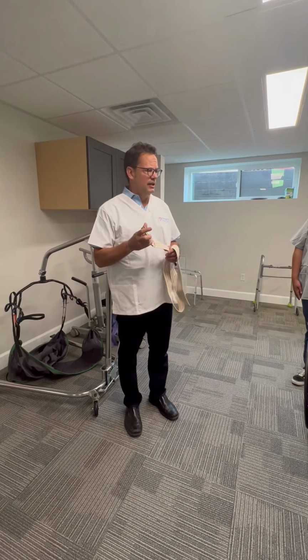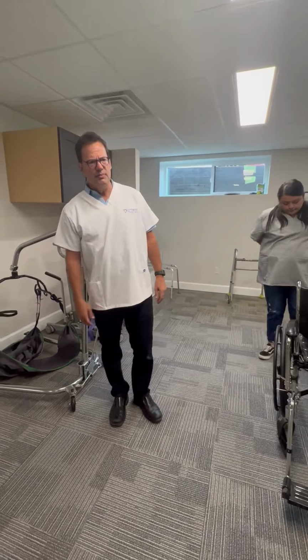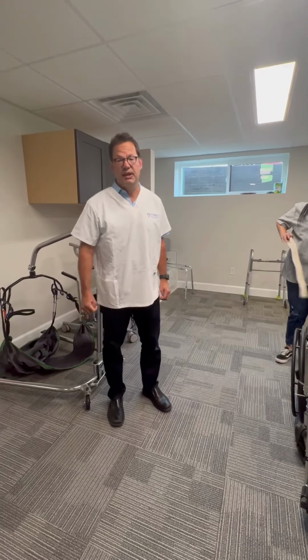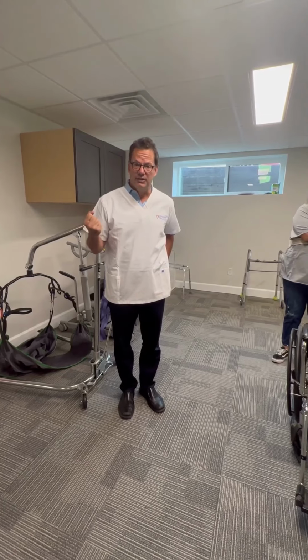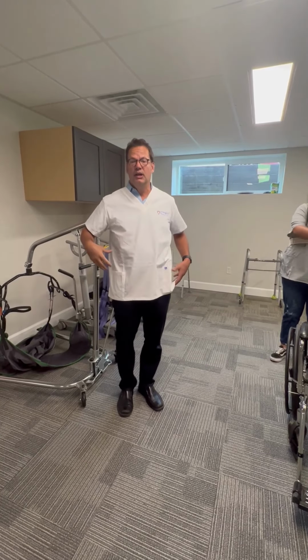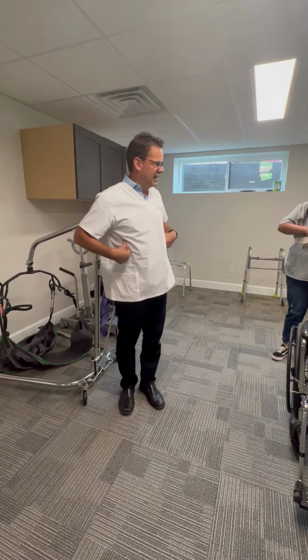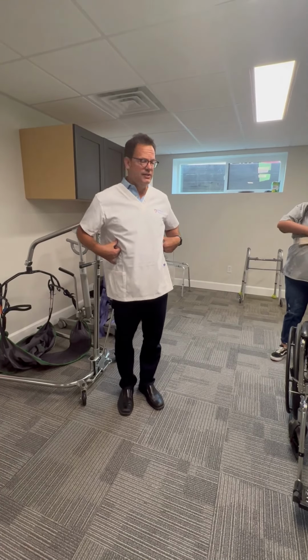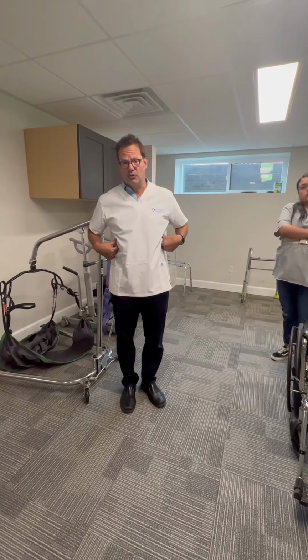So I'll ask you to put that belt on, Giselle. It is very important that we keep that in mind, because if we're actually going to be holding that belt and try to prevent a fall, you are going to injure yourself. So keep in mind the idea of the belt, if there is a fall, is to allow us to safely lower our clients to the floor.